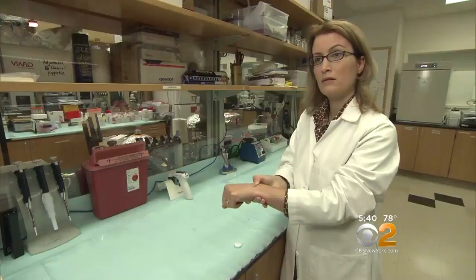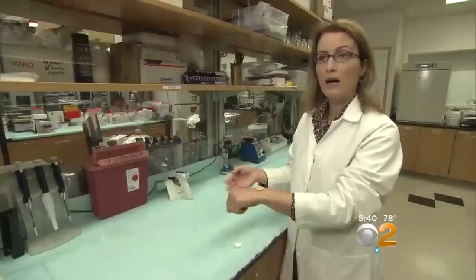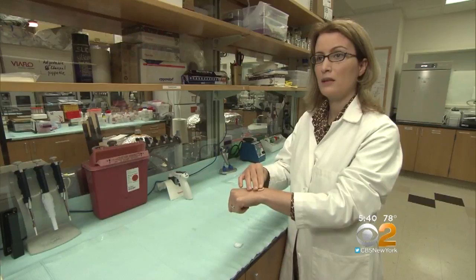You hear a small click, and the microneedle patch is applied. Researchers from Emory University and Georgia Tech showed us how it works. I leave it for a few minutes there, and then I will just remove it. A new study in the Journal of the Lancet looked at 100 healthy adults.